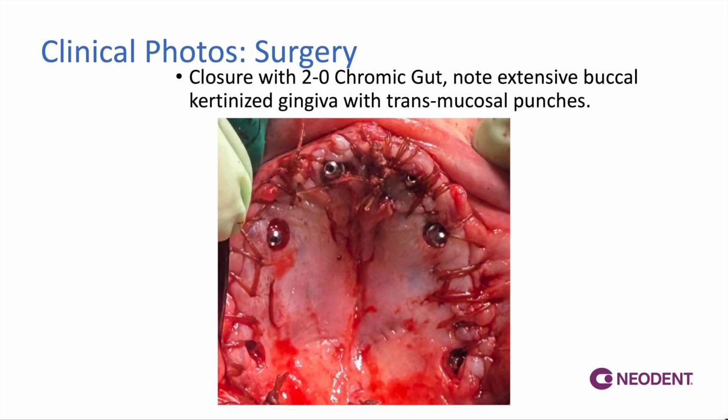That lets us know that we have appropriately thinned and trimmed our palatal tissue, and we have actually brought that buccal. So now not only do we have adequate buccal bone, we actually have a very nice palatal connective tissue or palatal keratinized tissue buccal to all of our multi-unit abutments. This will resist any insults that the patients can throw at them longer term.